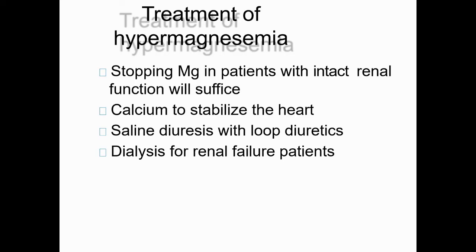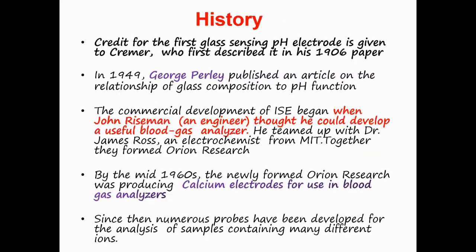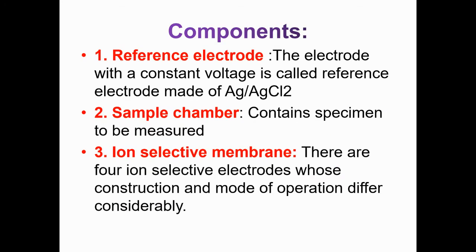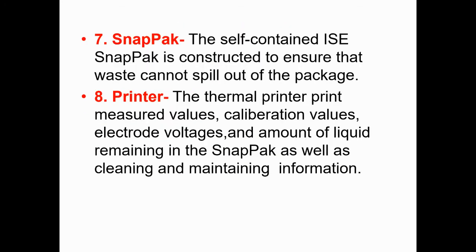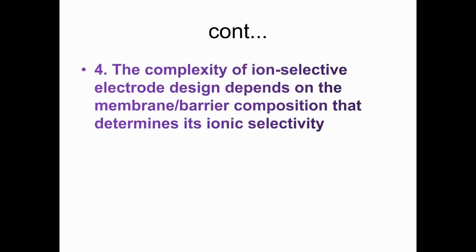In electrolyte analysis, we saw the principle of the electrolyte analyzer, the history behind it, the components, and the working or sample processing of this instrument.